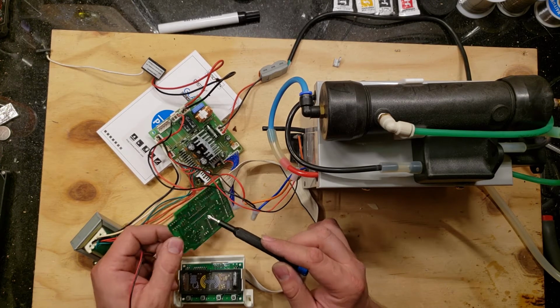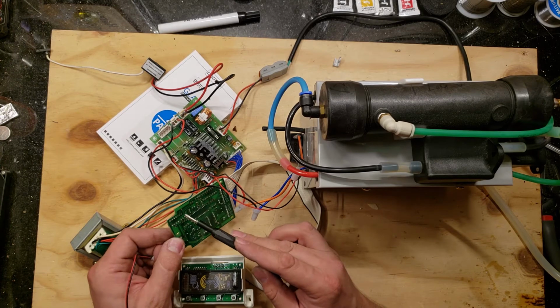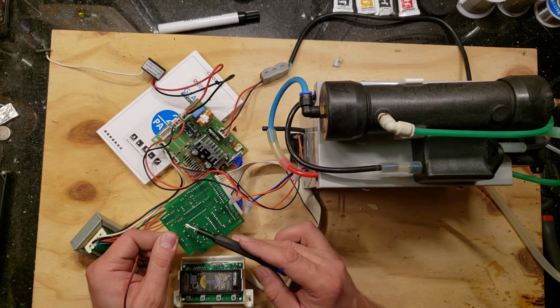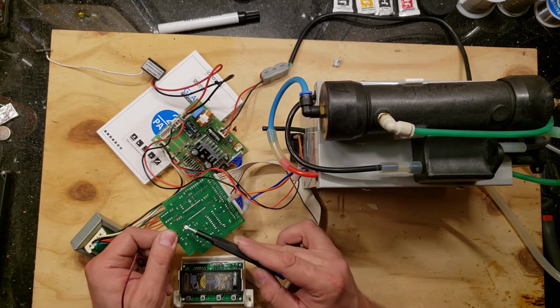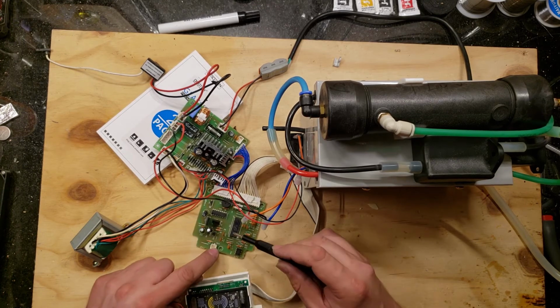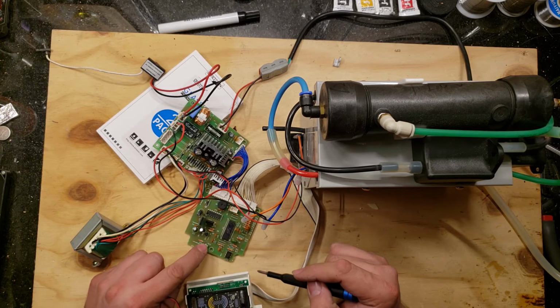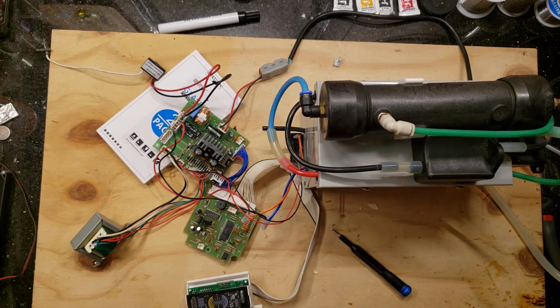Okay. Now the resistor that's been clipped out, the R20, is that right next to? Okay, so R20 has been clipped out, and this is going to the chip. Okay, so it looks like this is a voltage divider for an input on this chip. So I wonder how big that resistor was. Should I just throw a random resistor on there and see what it does? We have red, red, orange. Do I have a red, red, orange?